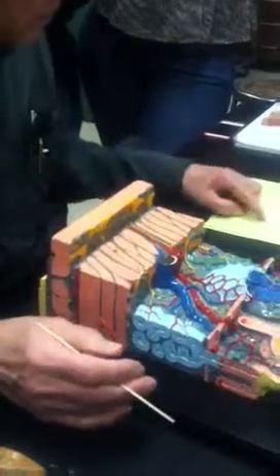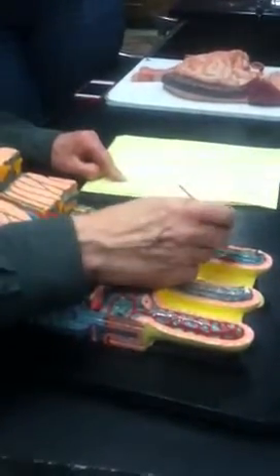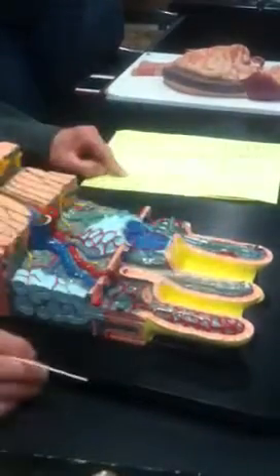So we've got muscularis mucosa. We've got a lymph node right here. This whole thing is a lymph node. We've got wandering lymphocytes. You see a lymphocyte out here? They wander away from here. See them wandering away? And here is a wandering, usually I point to one of these and I ask you to identify it as a wandering lymphocyte.